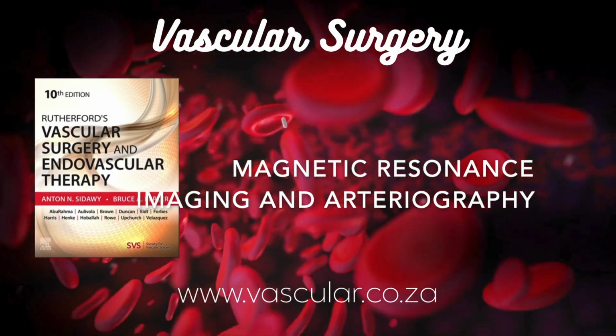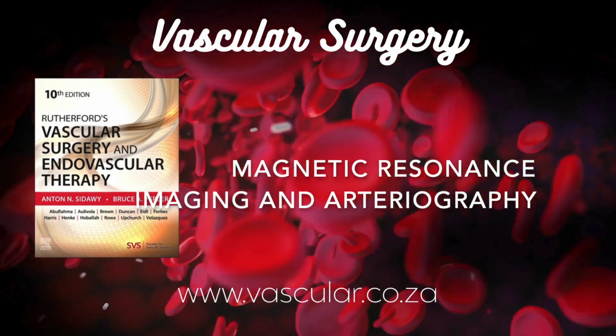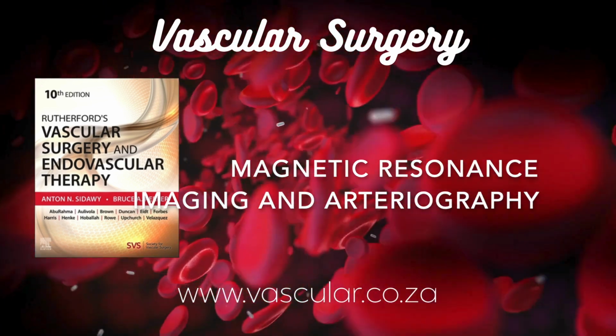Another powerful technique is volume rendering, or VR. This often gives a more 3D-looking, shaded representation of the vessels. Sometimes it's even better than MIP for understanding complex anatomy. Okay, great processing tools.